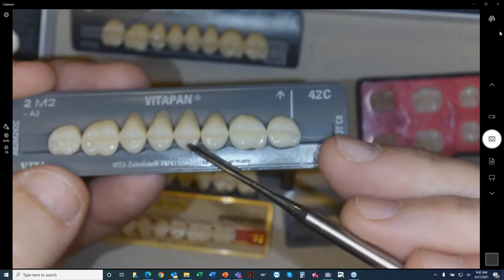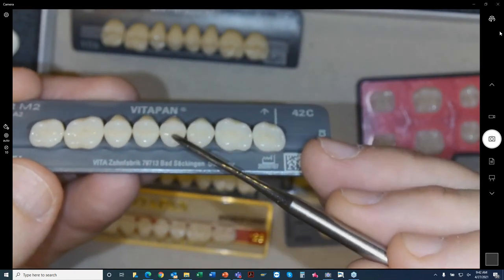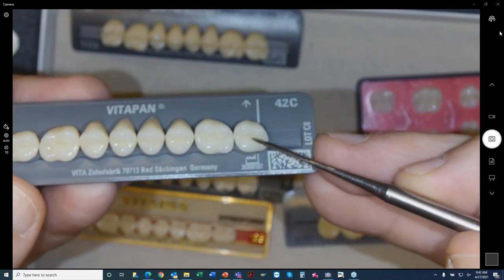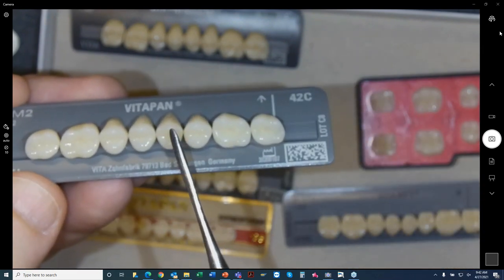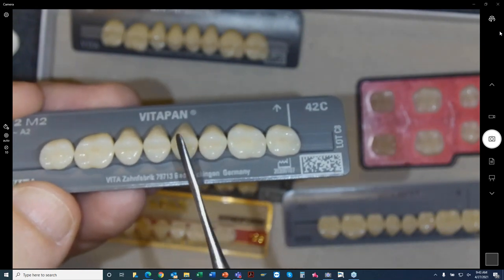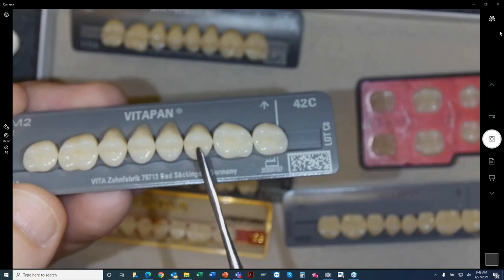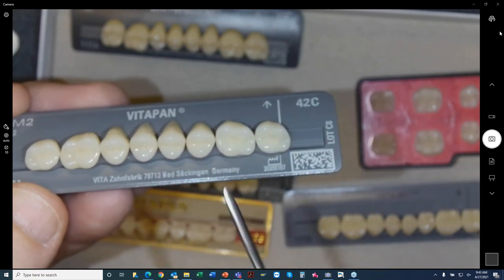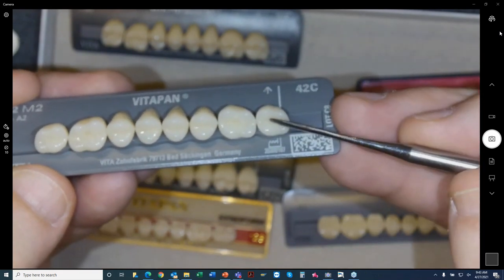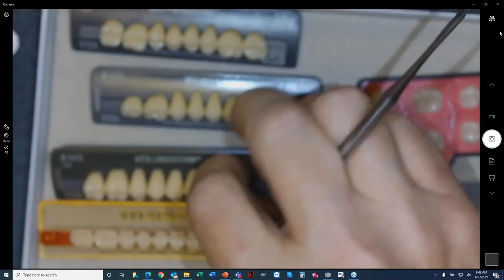These, same thing, they start from 28 degrees and shallow down to 23 degrees. So just like natural teeth, you use the incisive edges, the cuspids, bicuspids, they're still slicing and dicing the food, and then your posteriors are compressing it, mortar and pestle type, and they are a little bit shallower to have that food move back into the patient's mouth.